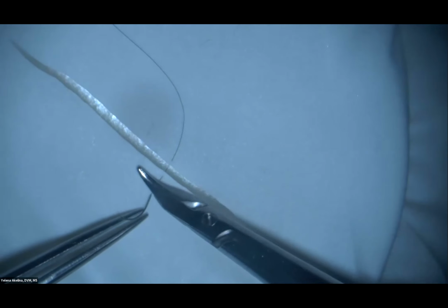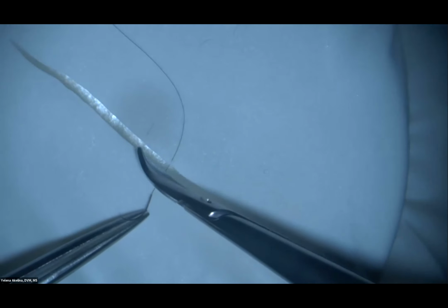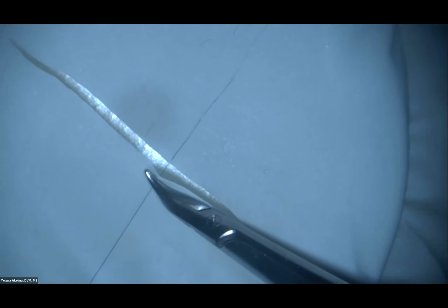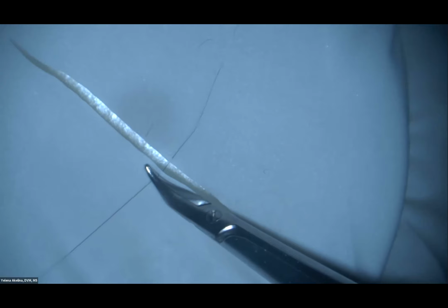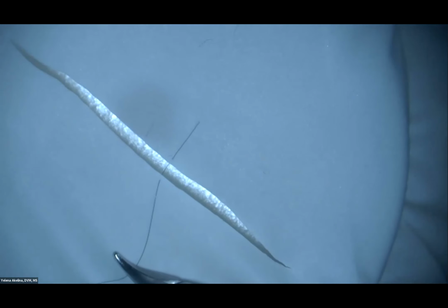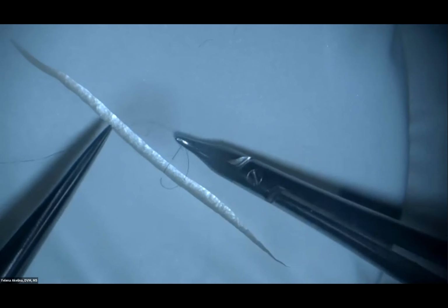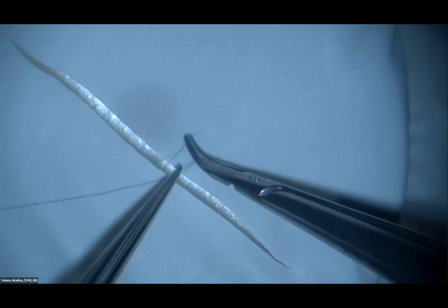I'm going to zoom in, zoom out. The motion of the instrument is small pronations like this. Rotate a little bit, then I move in, put it in, and use a pretty big loop to tie. We're going to use three square knots and one surgeon's knot to bring it together, because there's a lot of tension in the beginning.